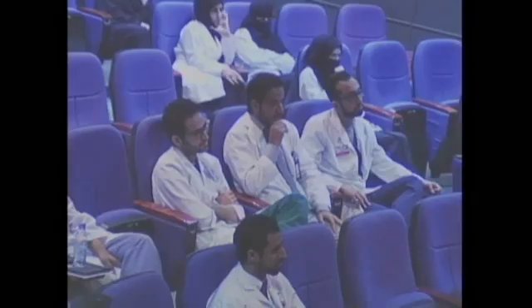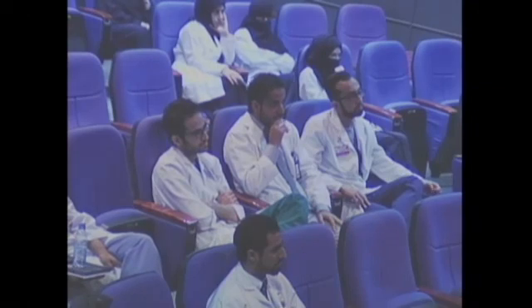My second question is the lowest thickness allowed for you without epithelium. It's fixed for LASIK, but for PRK it's not yet established. What is it for you? For me, 450. Without epithelium? Without epithelium, and for low degrees, because I don't like to go over 4 diopters with PRK.